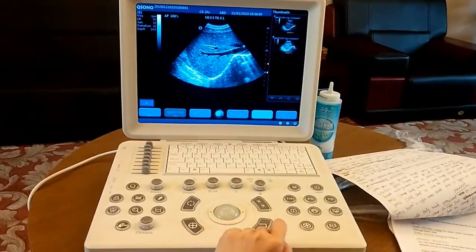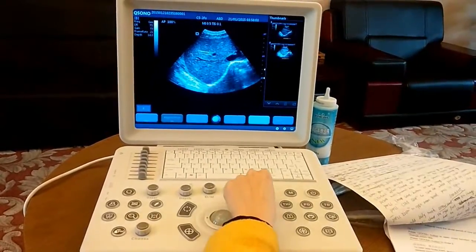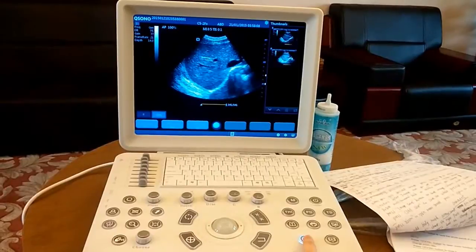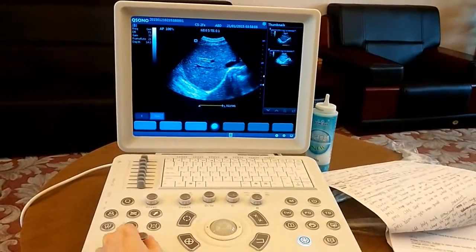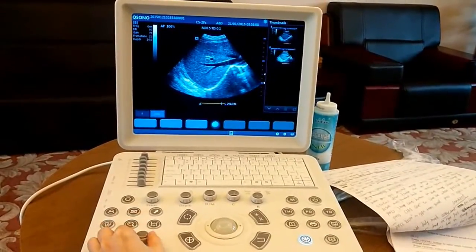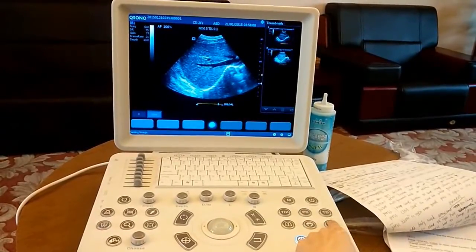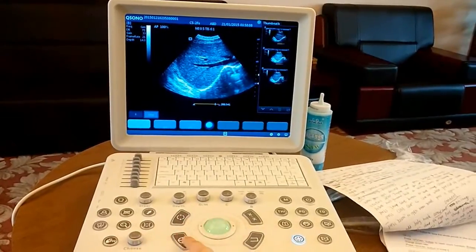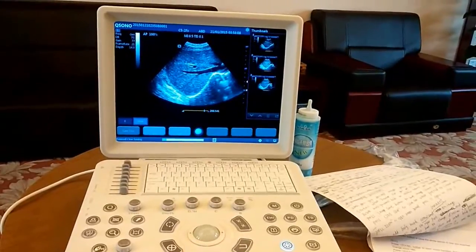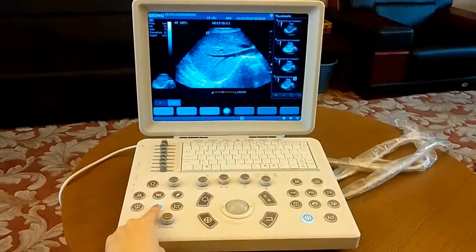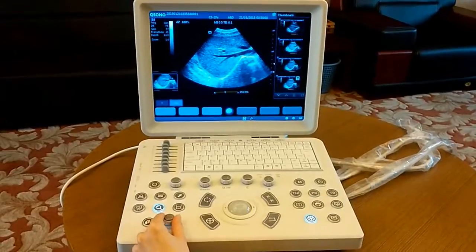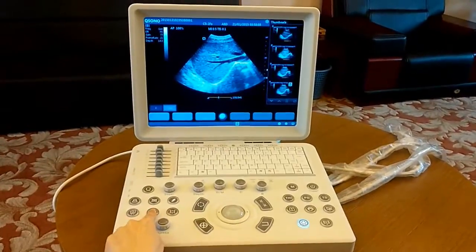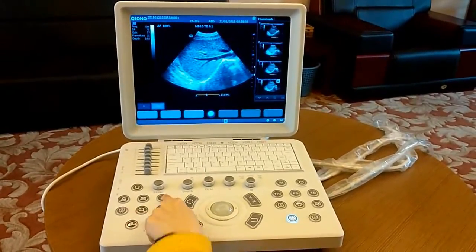Now we scan images in B mode. When you get a desired image, press the freeze button to pause scanning. Rotate the knob to review frames you scanned. Press the image save button to save the image currently on the screen. Click cinema save to save the whole clip of the cinema you scanned. Press the zoom button to open the zoom function; rotate the knob to change zoom rate. Press zoom again to close it.